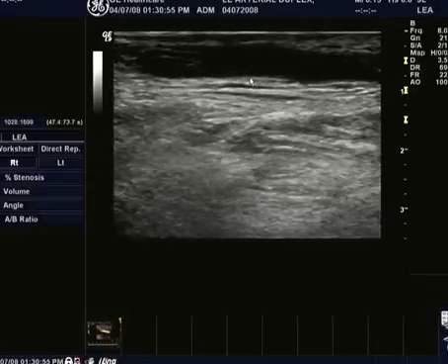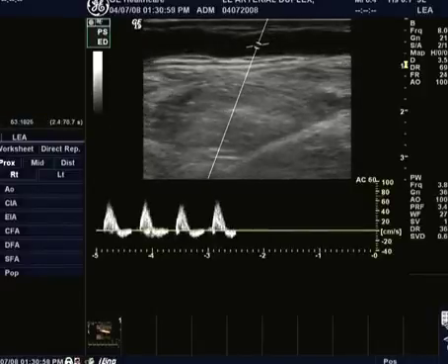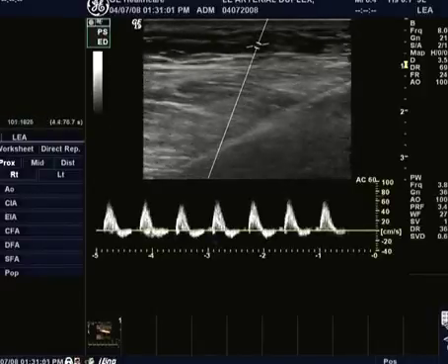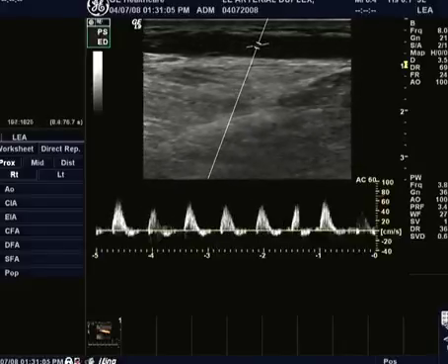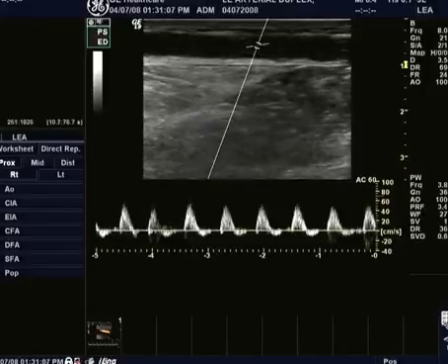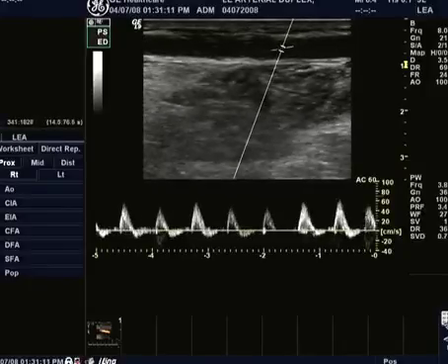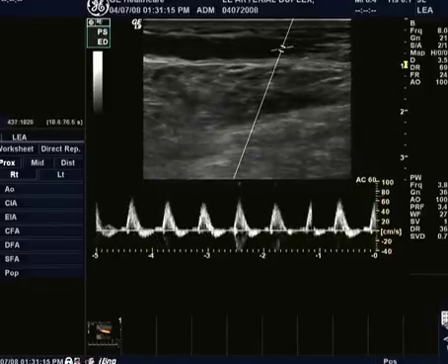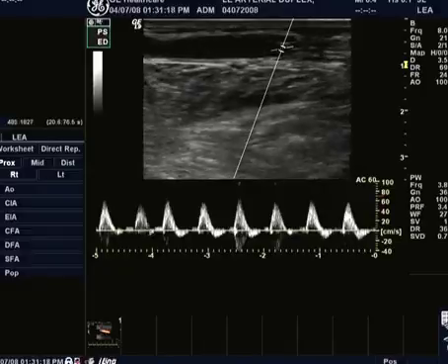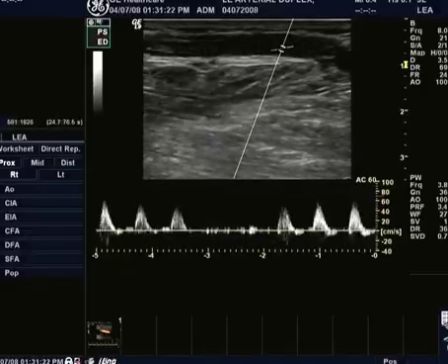And again, that vessel wall is very healthy. So we would continue to drive right on down, looking and listening. If you do this live in a duplex mode, you won't miss anything. If you're going to spot check, have it live, then stop the image and take a Doppler, and move and do this down the leg, you're going to run into trouble. You will miss stuff. So I like doing this live.